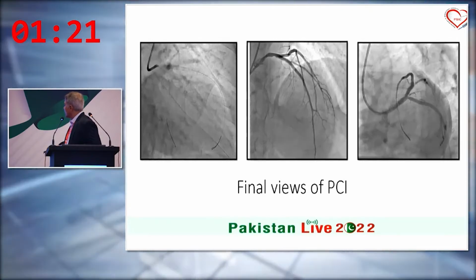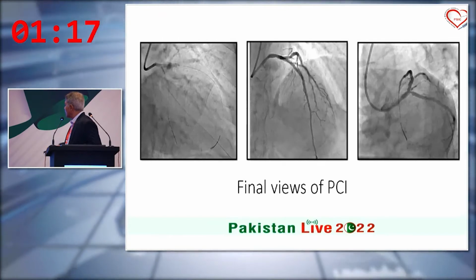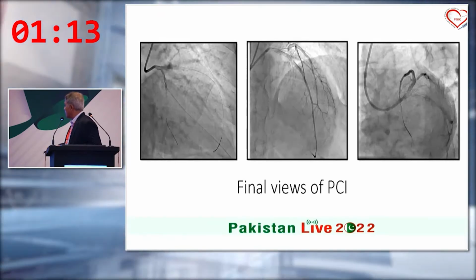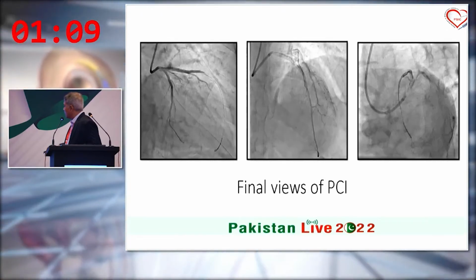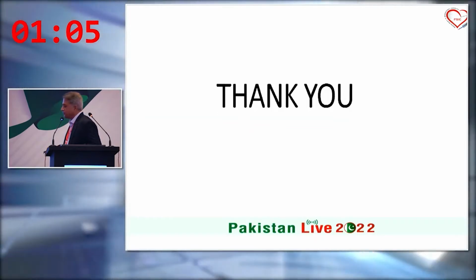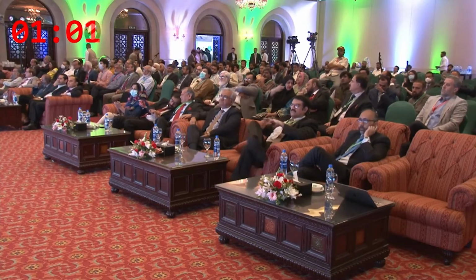As the patient was in ACS with raised troponin and the distal vessel had sluggish flow, Aggrastat bolus and infusion was given, and final IVUS after placement of the distal stent was not done in order to shorten the procedure. Thank you.